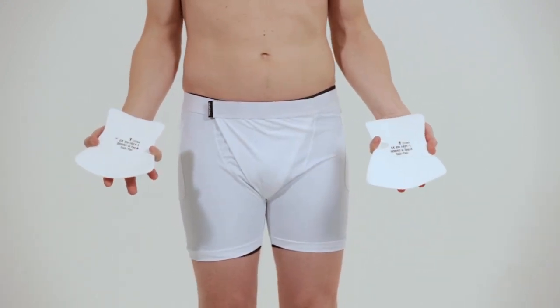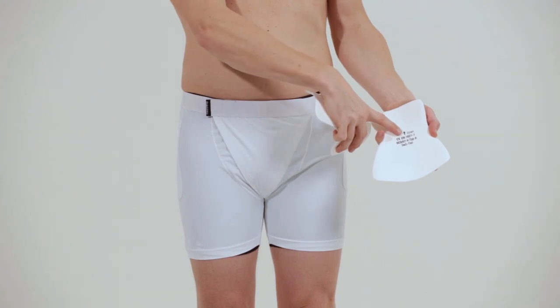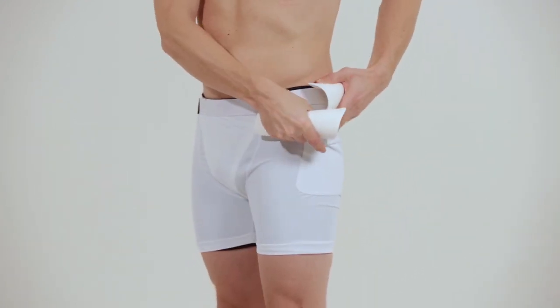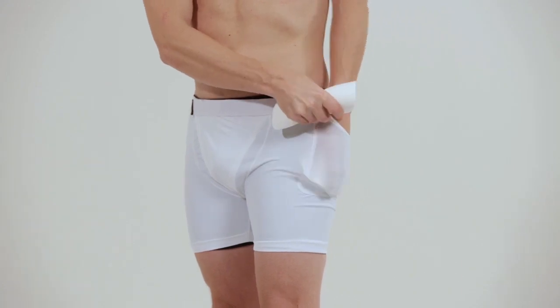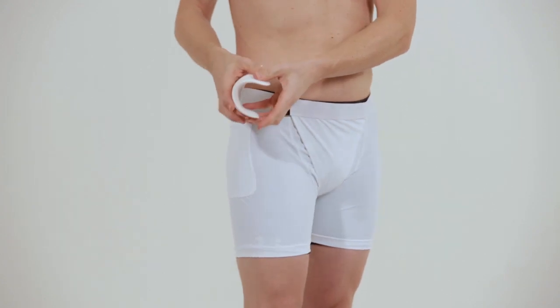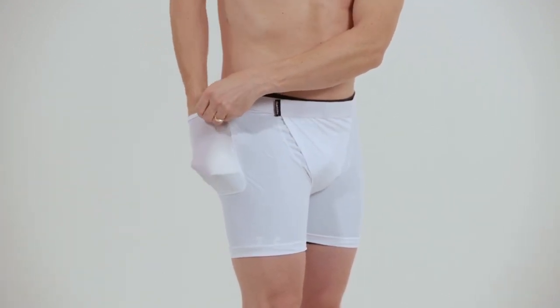On the inside of the pads there is an arrow that has to point upwards facing your body when inserted again. Adjust the pads inside the pockets and the fabric if needed.